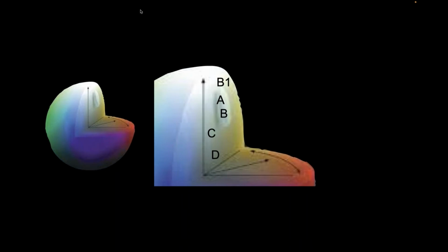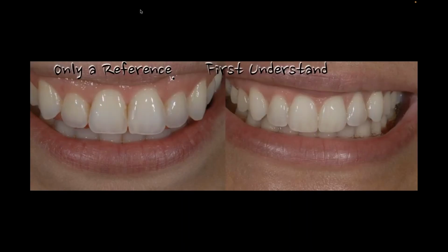Also, the interesting fact there is the B1 that is sitting outside that shade guide. Just so you know, from statistics, it is the most remade shade in the country, B1. So it's the one that people used to pick the most years ago, before all the bleaching craze hit. It was also the one that was remade the most because it never looked as natural. Twofold, technician-wise, maybe we didn't support our B1's value as well as we should have. And then aesthetics-wise, it never really blended or harmonized as well with the face because of the fact that it didn't really fit into the tooth color world.